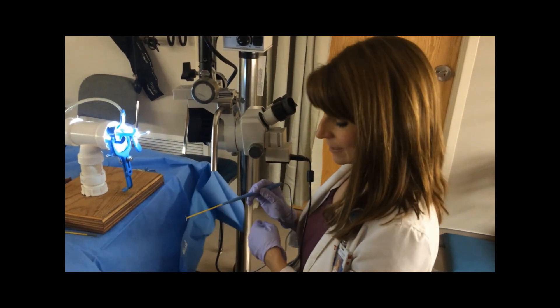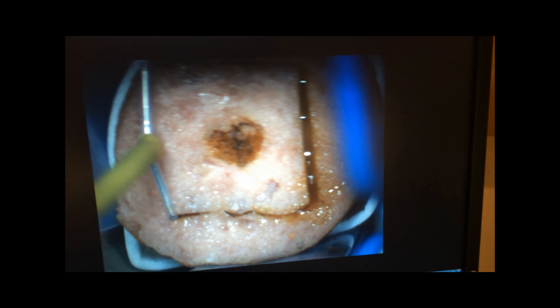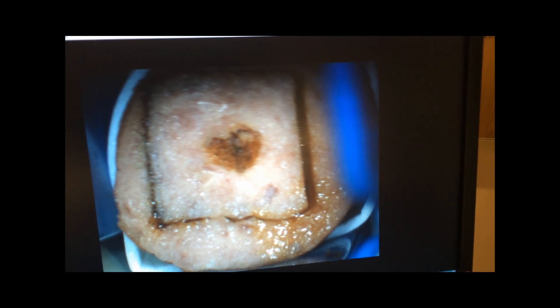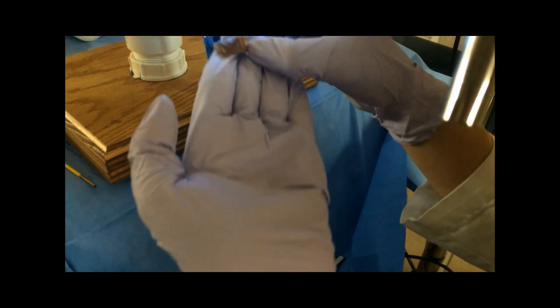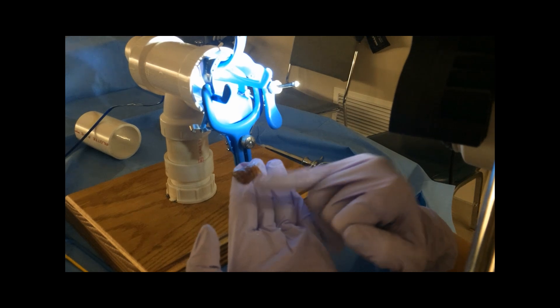I am getting some drag — I'm just going to keep going and actually go farther than what I think I need to go. I'm very pleased looking at that specimen. You can tell that I was deeper when I first started and I came out a little bit. It's really hard not to do that and it's reasonable to some amount — you just don't want it to be too extreme or too shallow when you end.